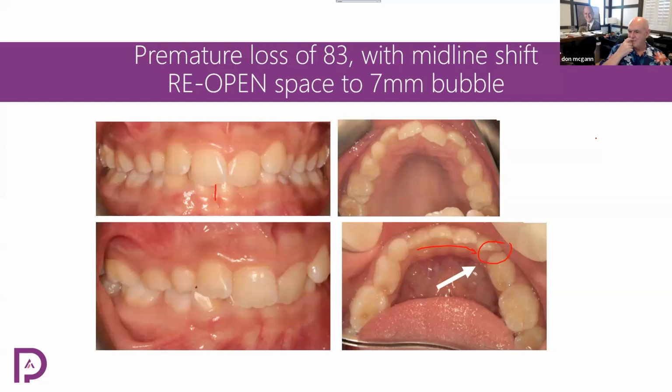So you say, I'm going to get a 5-year aligner package, and for the first year, I'm going to intrude these incisors, upper and lower most likely. And is intrusion easy to do? How many fixed cases do we even get, and we're still looking at deep bite after 2 years? It never really leveled. It never really got there. So spend a little bit more time on it in phase one. Let's intrude upper and lower on these trays. Let's straighten these teeth. Let's get some overjet. Let's advance those lower incisors to coordinate with the upper, and let's get 2 millimeters plus anterior overjet. I've got a growing patient.